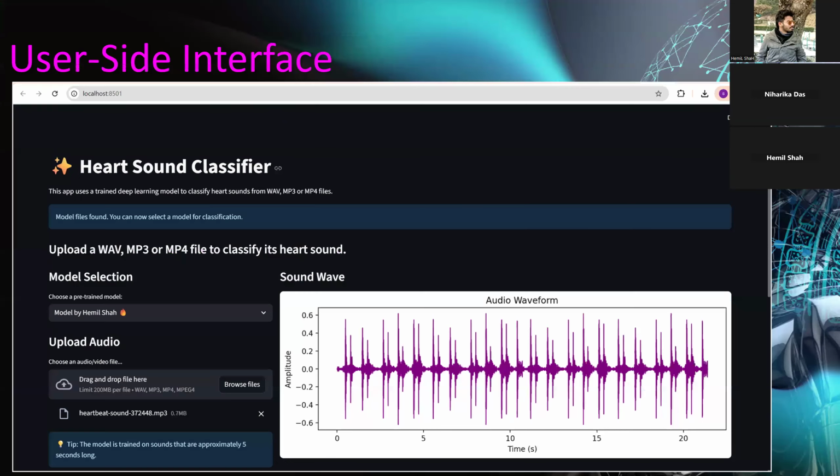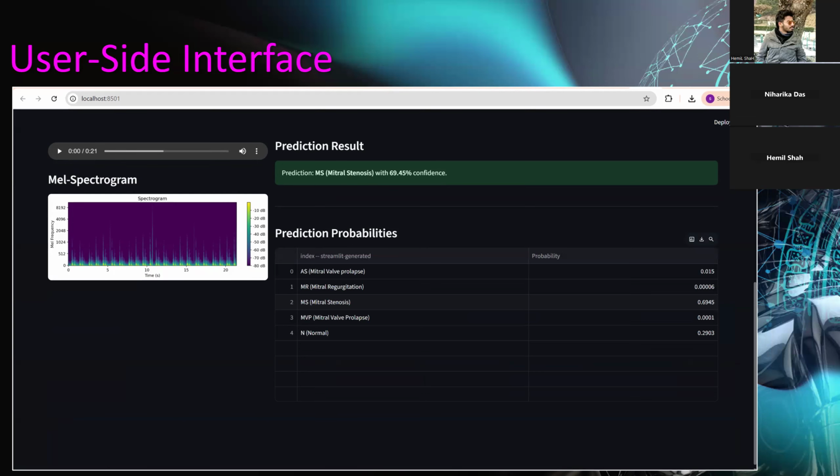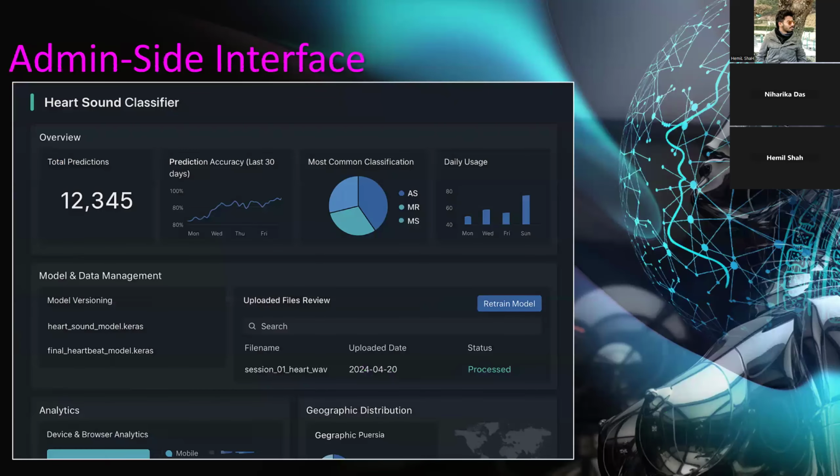Then the interface preview. As I mentioned, there is the sound wave of the user input. Here the user inputs an MP3 file as an example, and there is a sound wave with the timestamp and the amplitude as well. There are two models from which the user can choose: one is made by me and one is made by Niharika, my partner. And then here is the spectrogram with the results. As you can see, the results can be downloaded as well in a CSV file with the probabilities. That was the user side interface, and this is the admin side interface which Niharika and I manage. Here we can see the daily usage, the total predictions overview, the data management and analytics as well.